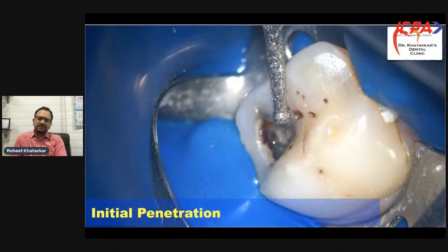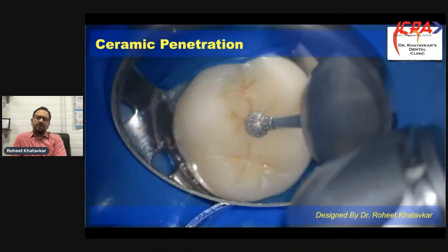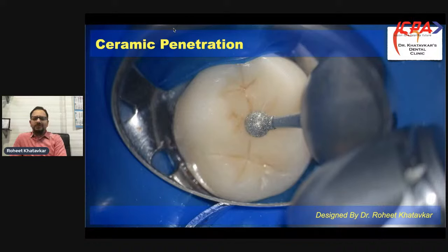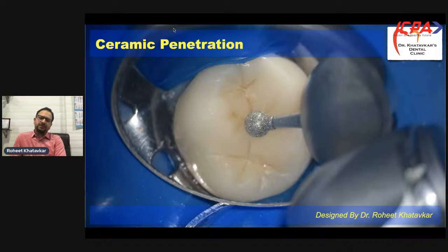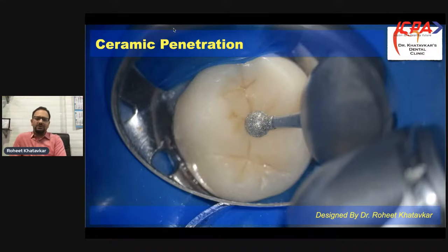One of the burs I use for about 80% of my cases has a combination of a round and a tapered cylindrical bur. The round bur reduces chances of the bur slipping when starting access cavity preparation, and the tapered cylindrical bur helps extend the access cavity along the lateral surface of the tooth. For access opening into a metal ceramic crown or zirconia crown, specifically designed burs help avoid ceramic chattering or cracking — these can be used for both PFM and zirconia crowns for gaining initial access.